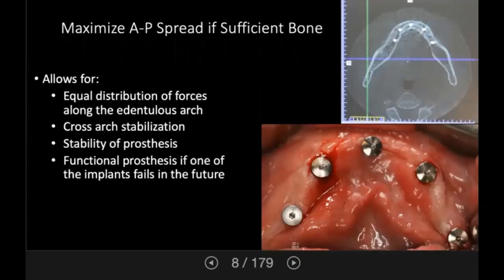If an anterior implant is planned, it should offset the midline as this is the thinnest portion of acrylic in the mandibular denture and is prone to fracture. Midline maxillary implants or implants in the maxillary central incisor locations are also not recommended as they are typically in close proximity to the incisive canal and the increased thickness of the anterior maxillary denture may lead to patient aesthetics and phonetic issues.